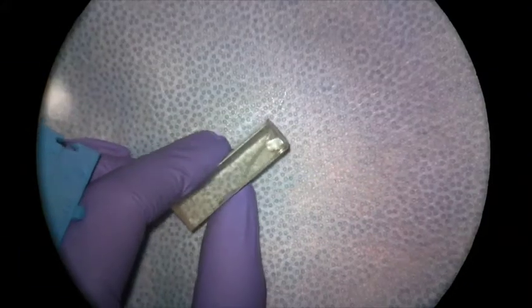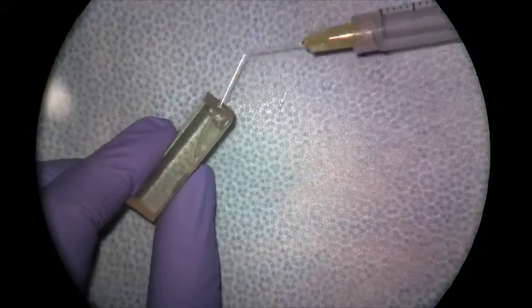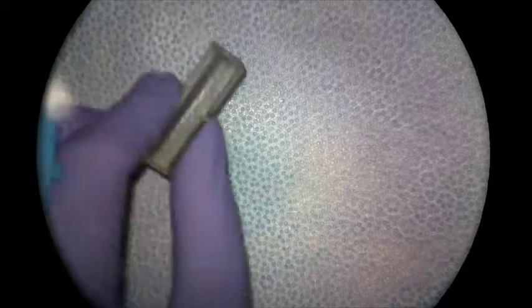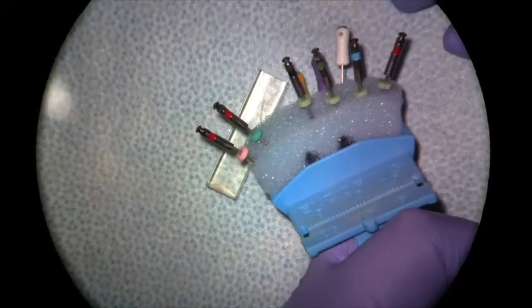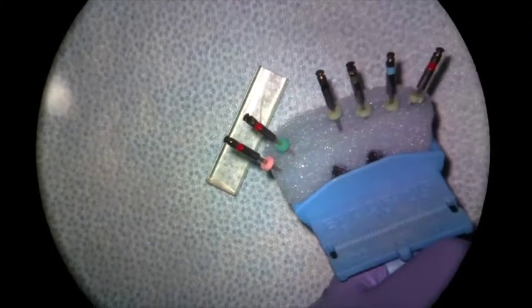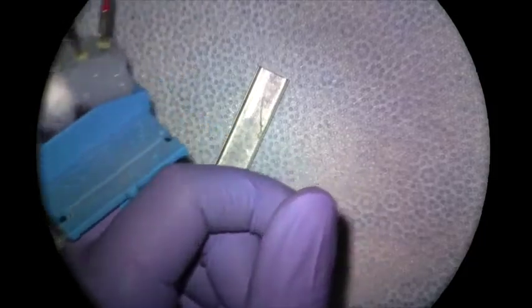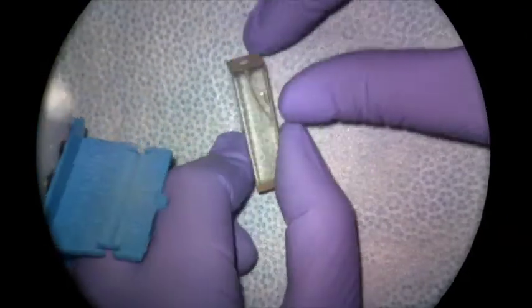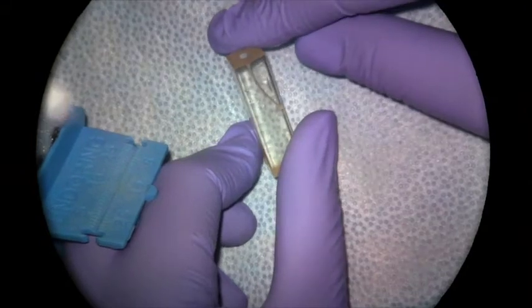At this point, if we're happy with our length and we have a good smooth glide path, we'd be ready to move on to our rotary instrumentation. The first two files you're going to use are the 25.10 and the 25.08. These are our orifice opener files — they're going to create space coronally in the canal so that the 04 series files can work deeper toward the apex.